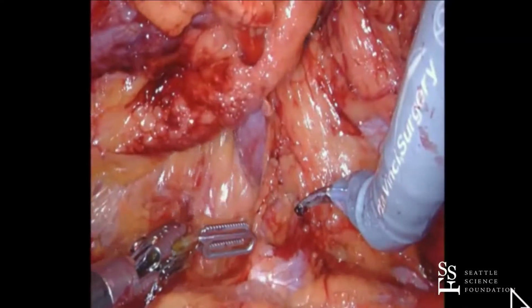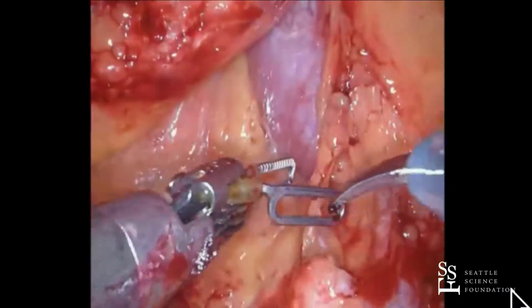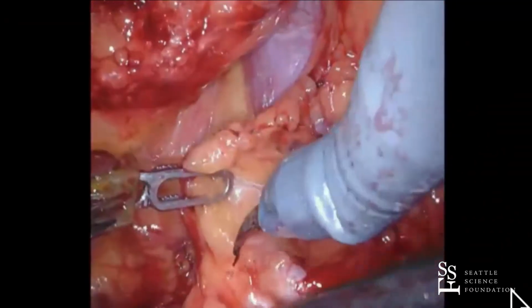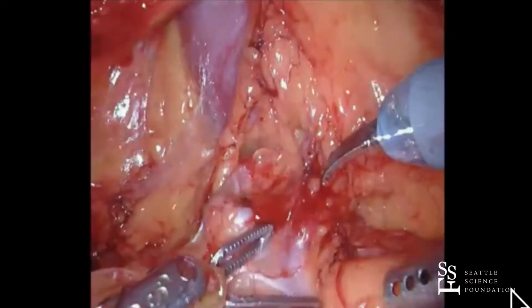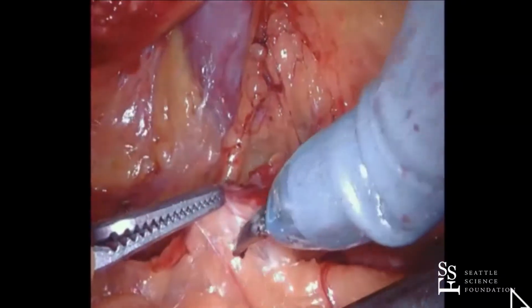Has anybody used the robotic suction? Is the question. Forget it. Robotic suction. Looks like nobody's using it. I don't use it. I tried it once when it looked cool and never used it after that. Yeah, I mean, it's just not dynamic enough, you know? You're used to parallel dynamic movement and it goes against the normal flow.